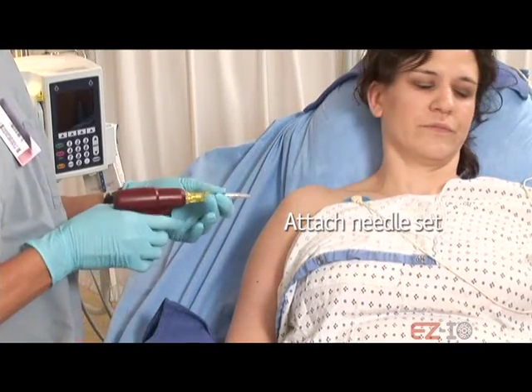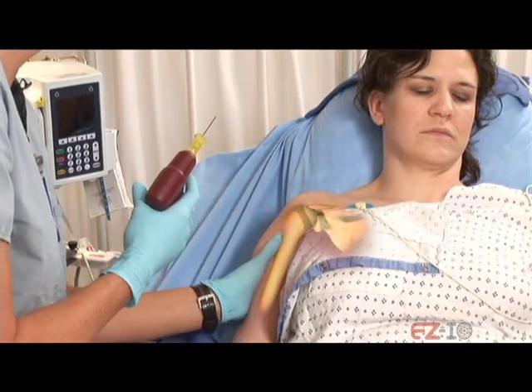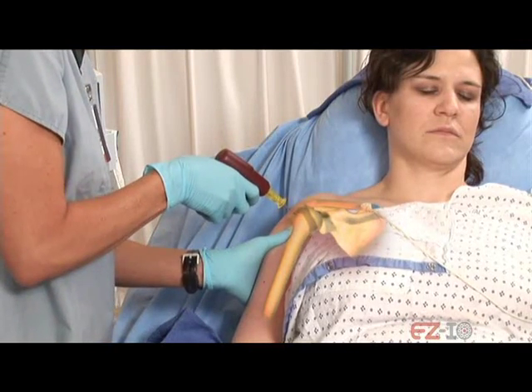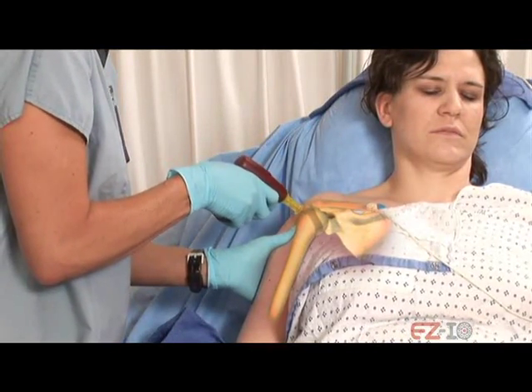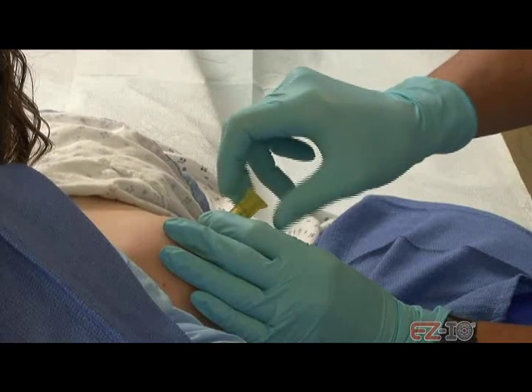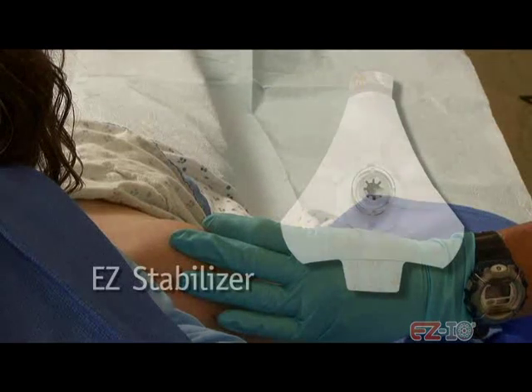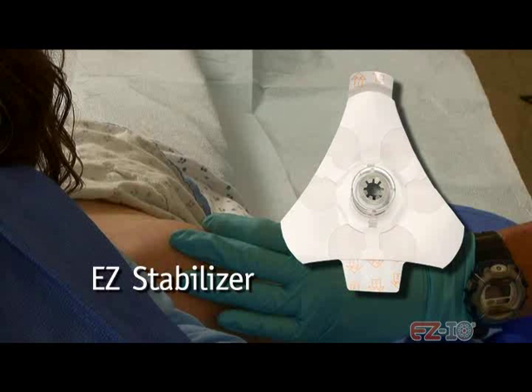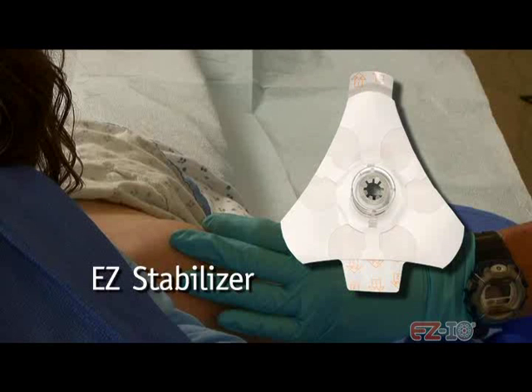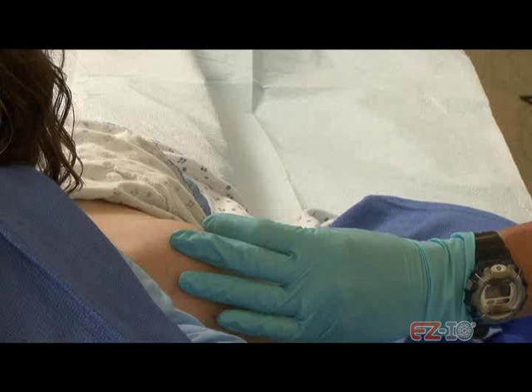Attach the needle set to the power driver and remove the safety cap. Insert the needle until it is touching the bone. Verify there is sufficient needle length. Power the driver and advance, applying limited pressure until you feel a change in resistance. Stabilize the needle set hub and remove the power driver. Remove the stylet and dispose of it in an approved sharps container. We recommend you use the EZ-Stabilizer when accessing the proximal humerus and when placing the EZ-IO in pediatric patients. In the next scene, we will demonstrate placement of the EZ-Stabilizer, but for the remainder of this video we will show the catheter in place without a stabilizer for visual clarity.